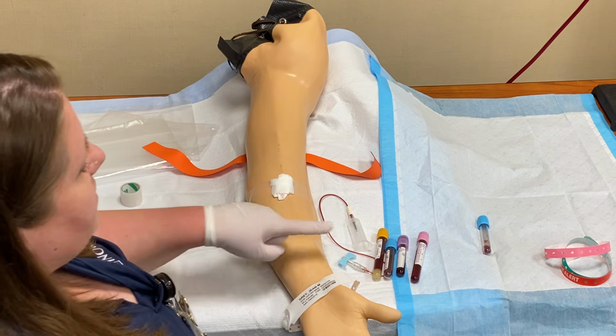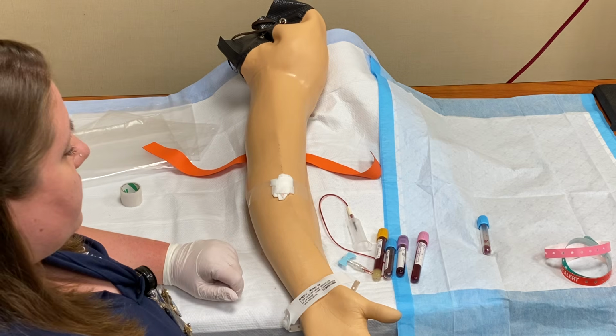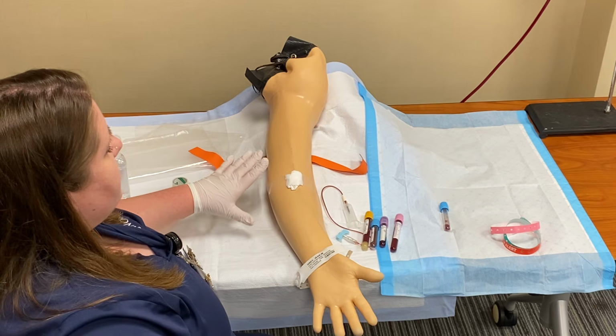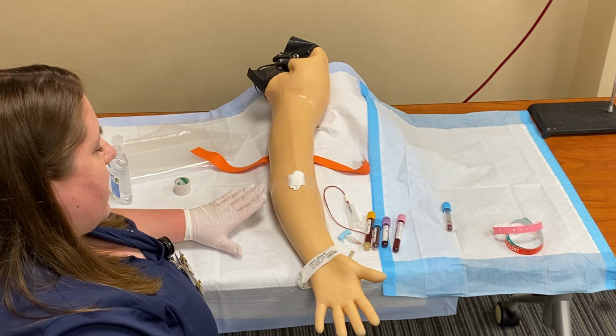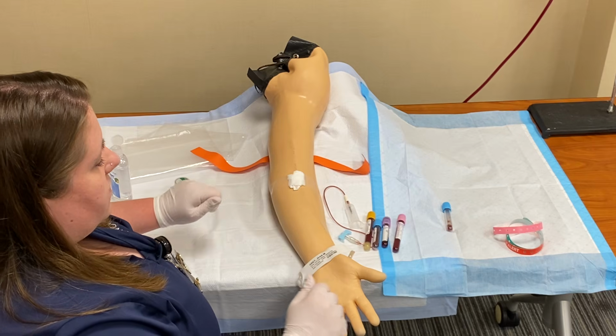So now I've collected my sample. The next thing I'm gonna need to do are get my labels. I have to go back to the computer to do that. I wanna make sure my patient is always safe. If I've raised the bed to do my phlebotomy and I have to leave the bedside to go to the computer, I'm gonna put the bed back down and raise the side rails.